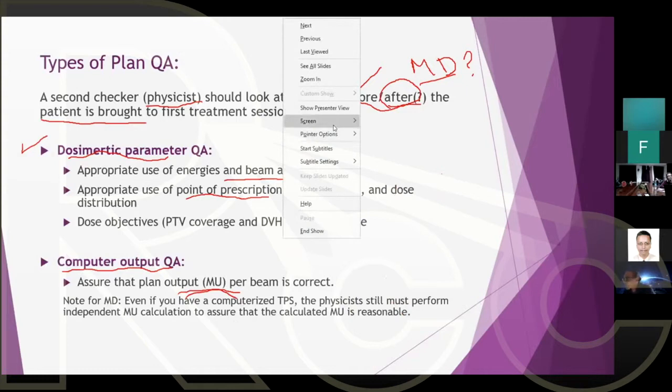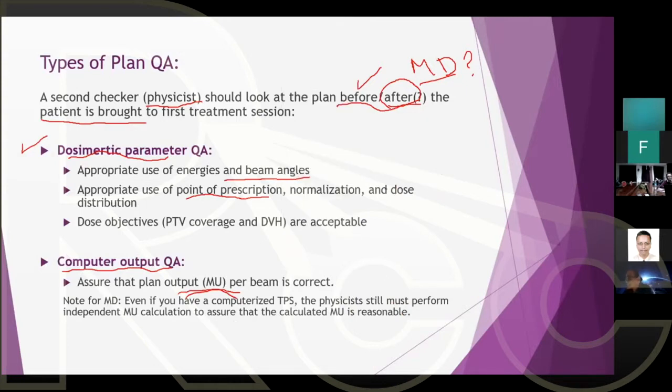Okay. Feel free to unmute yourselves if you want to answer this. So how do we make sure that the monitor unit is correct? What do we do? Well, I hope everyone knows that, unfortunately, us physicists, we have to perform monitor unit calculations.